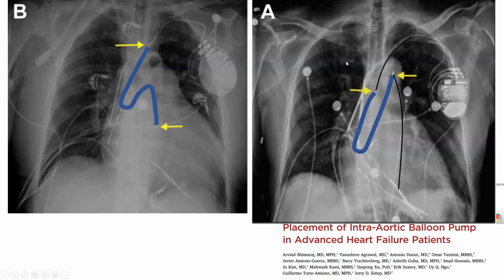Now, in more extreme cases, if you leave this alone, you will keep pushing and prolapsing this catheter in the ascending aorta. And you need to recognize this earlier. The earlier, the better. One group has identified that if that proximal marker is 5 centimeters above the carina instead of a couple of centimeters, you're already having this process early on, and you need to push it even at the bedside before you reach that stage where you need to go to the cath lab and straighten it with a wire under fluoro.